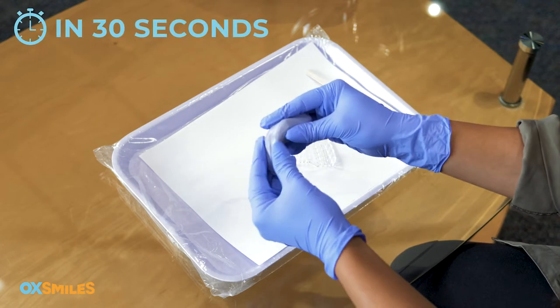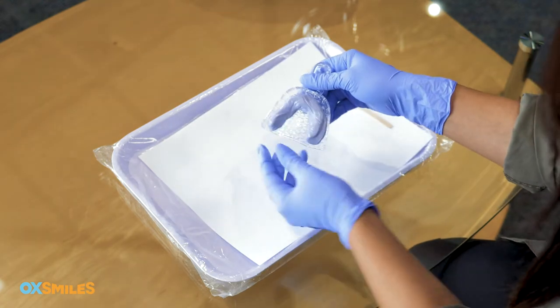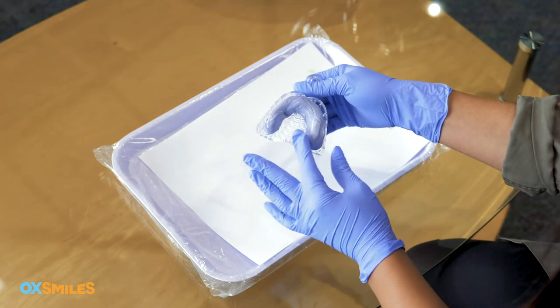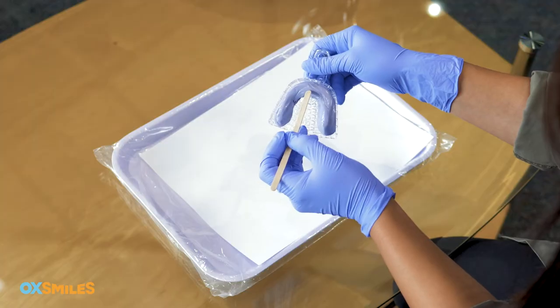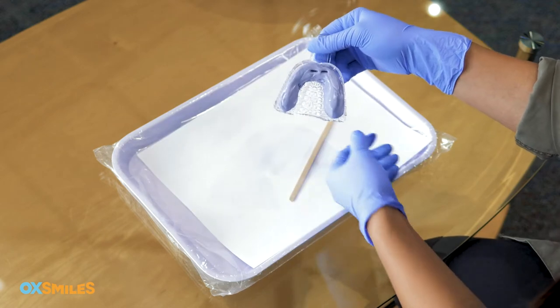Step five: in 30 seconds, form the putty into a four-inch tube shape, then within 30 seconds place the putty tube into the impression tray, filling the entire U-shape. Your front teeth need to be positioned here so your front teeth don't end up hitting the front of the tray. You can mark the area with a toothpick or butter knife using your mirror.